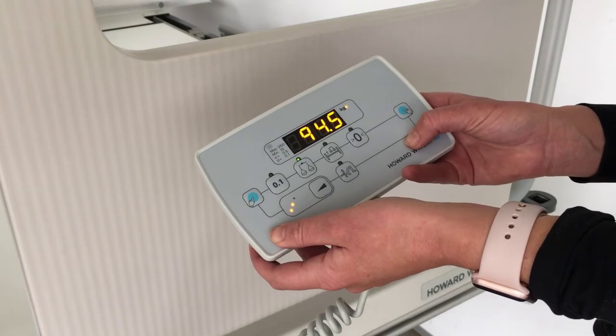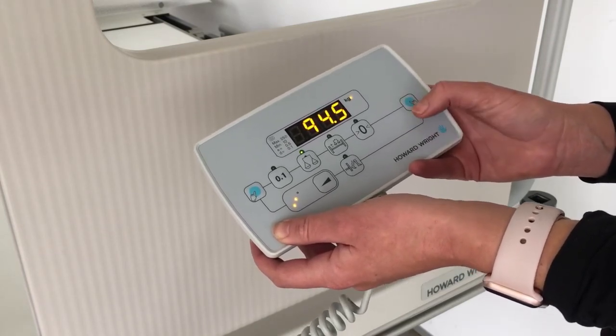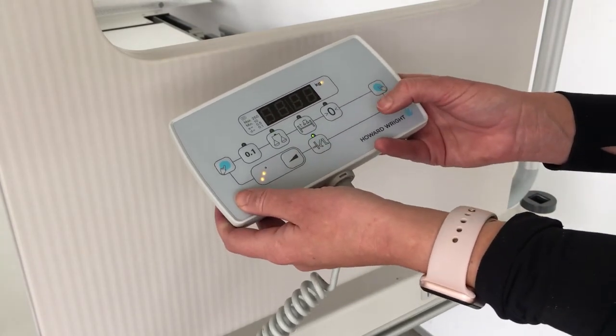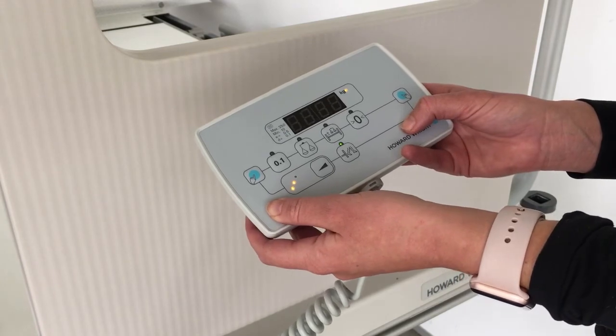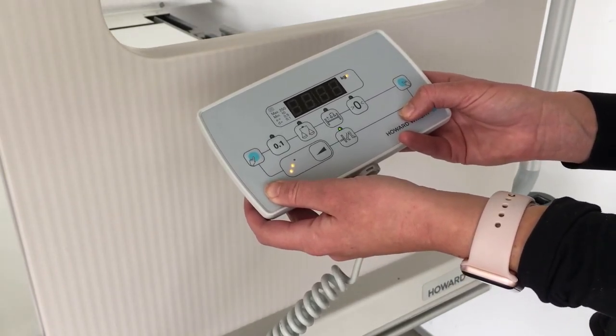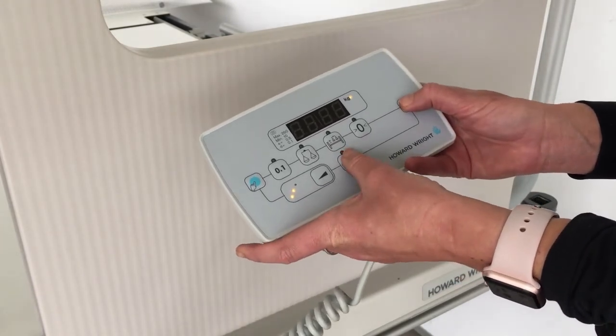To activate the bed exit alarm, the patient must be on the bed. Press and hold an operation button and the bed exit alarm button. The LED will illuminate green. If the patient exits the bed, an alarm will sound and the LED will flash red. To turn off the alarm, press the bed exit alarm button again.